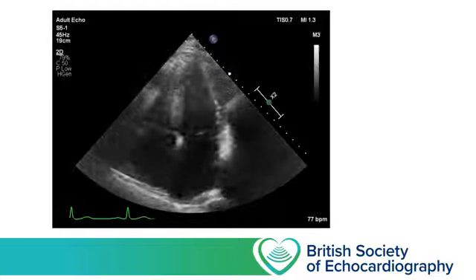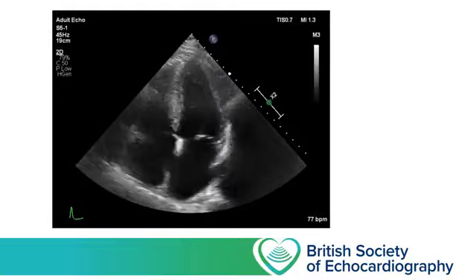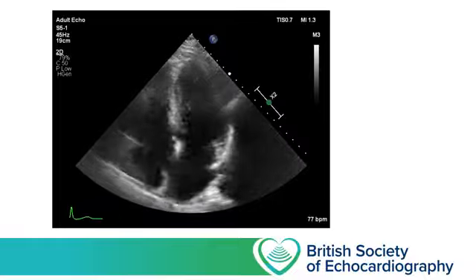So how can we exploit this principle and use it to generate an image that's practically useful for us, one that demonstrates the flow within the heart? So let's start off by considering how we can determine and represent the flow of blood at a single point in space. So this is an apical 4-chamber view, and let's imagine that we're interested in the flow of blood from the left atrium to the left ventricle during diastole.